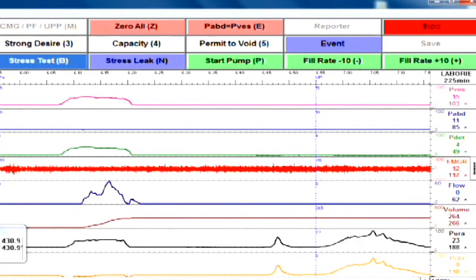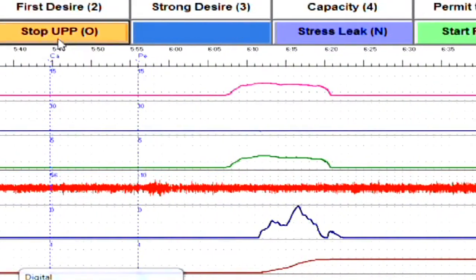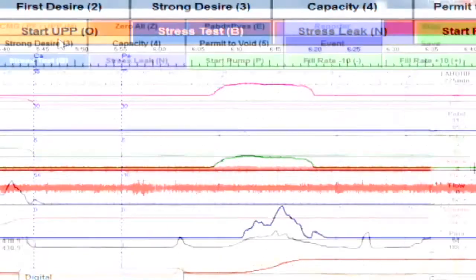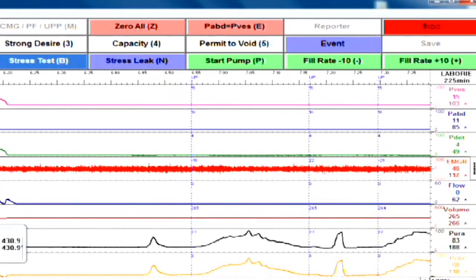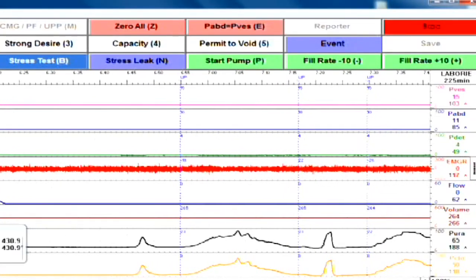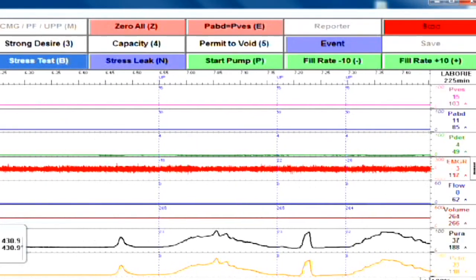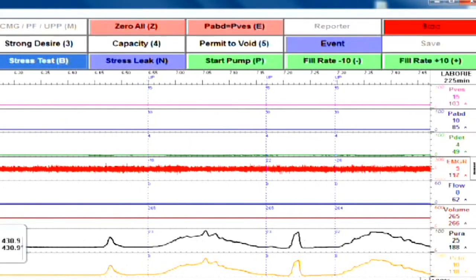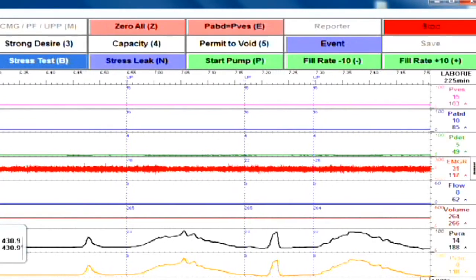Once the pressure has dropped back down to baseline, you will hit the Stop UPP button that is flashing. You'll then gently push the catheter back into the bladder and repeat the previous steps. It's a good idea to do a second pull to confirm the accuracy of the first pull. If the two pulls are similar in shape and rise to a similar peak pressure, you're then done with the UPP.